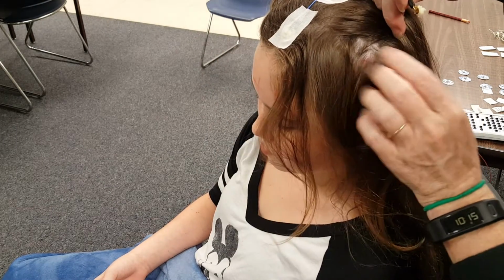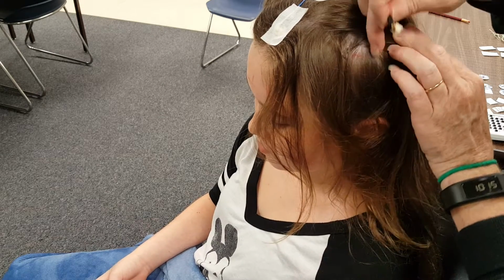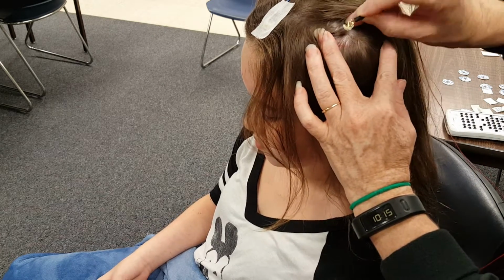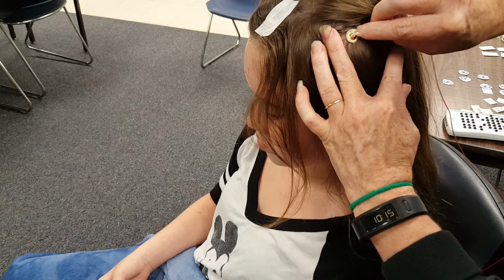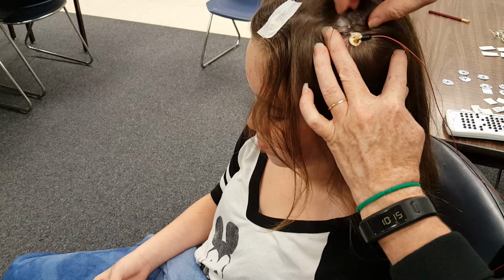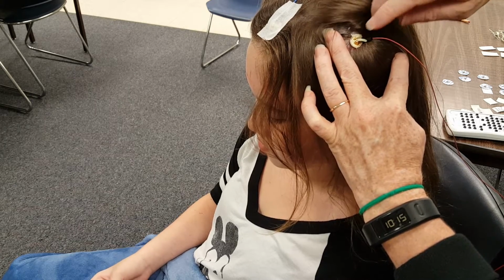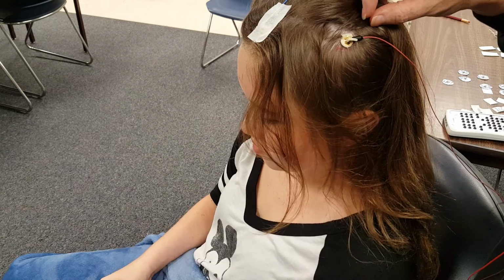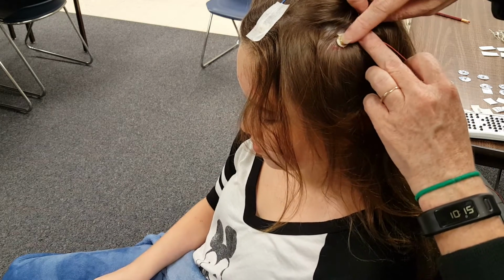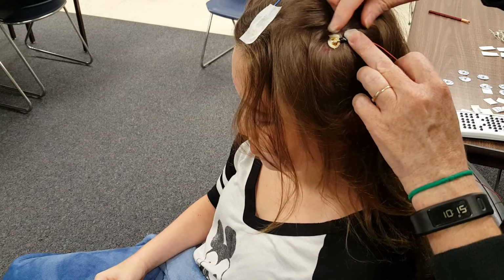And here I'm going to put on C3. So, can you tilt your head this way? There we go. So I just spread my hair out where I find my intersection, where I've prepped, and I'm just going to firmly push that down. And you're going to have some of your electrode paste, if you can see it come out the top of that. And then if you do have your gauze or your cover roll, we would go over it. If you didn't have the gauze, you just push your paste down.